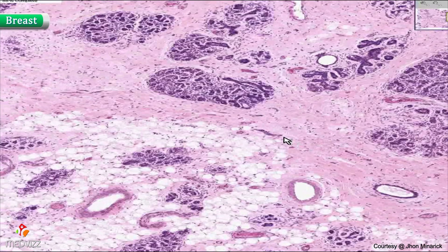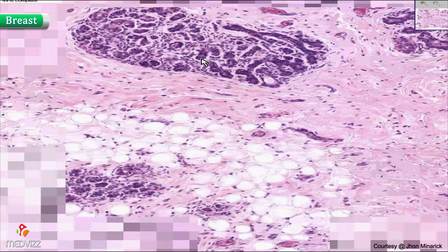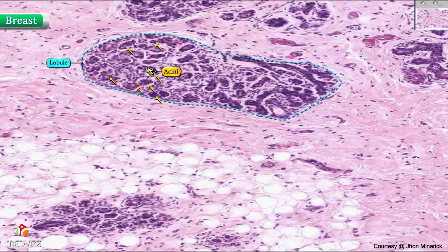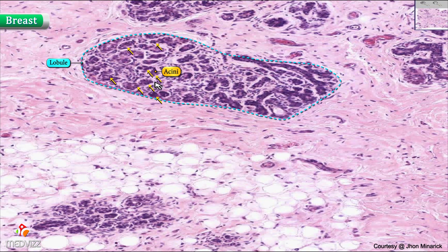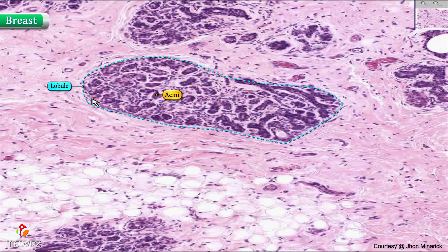At the next lower level, lower than the lobule, you have these individual structures here. These are the actual acini — sometimes they're called alveoli — and each acinus is separated by a small amount of connective tissue from other acini as well. Otherwise, this whole grouping is a lobule.